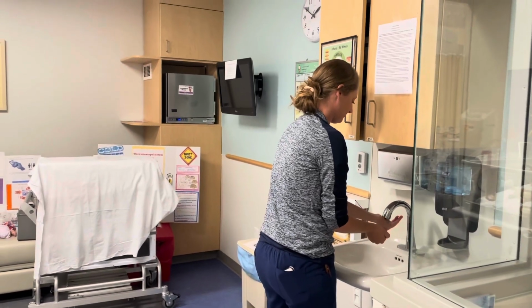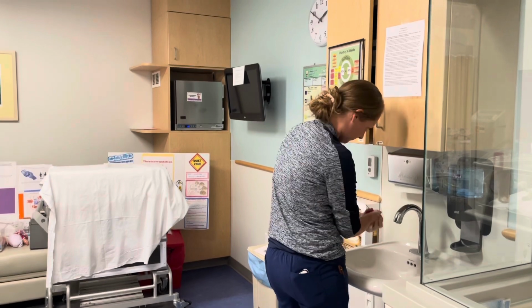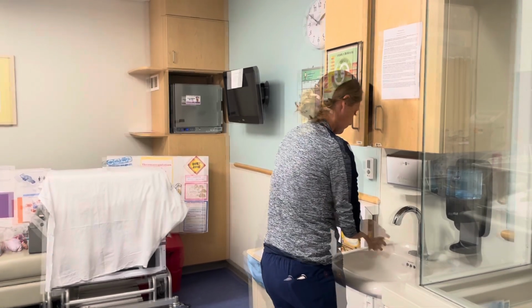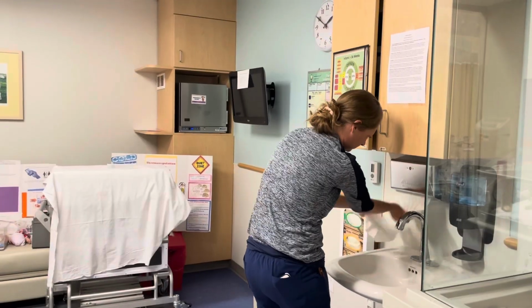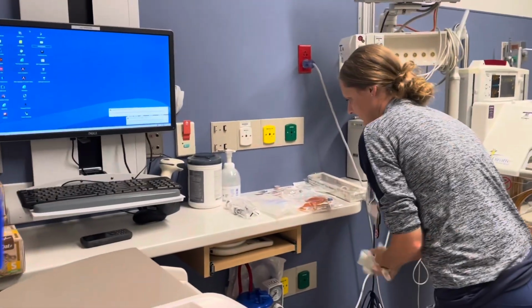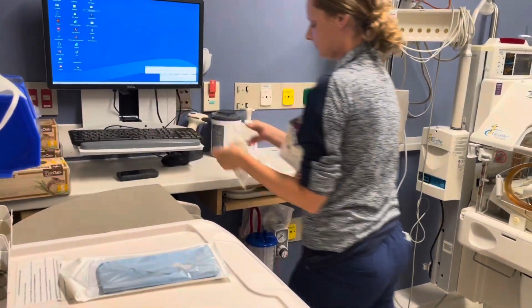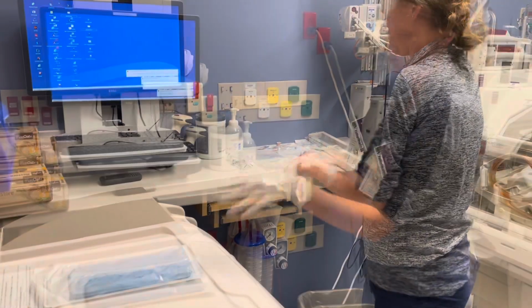This is a presentation on best practice for CLABSI prevention with a demonstration on central line changes for your UVC. Emily is now demonstrating proper hand hygiene by washing for a full 2 minutes, causing friction and cleansing all parts of her hands. Please note, per policy, Emily is bare below the elbows, not wearing a watch or rings.